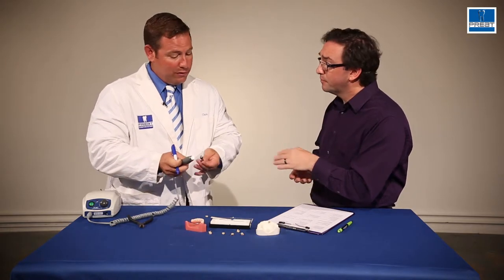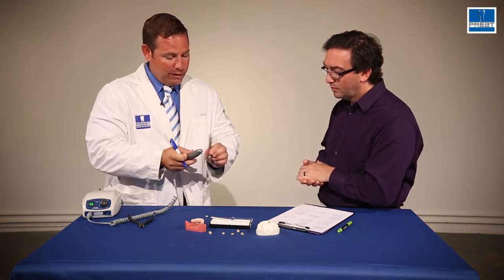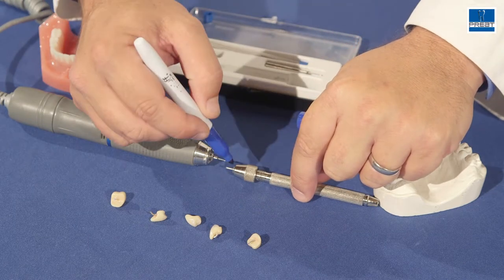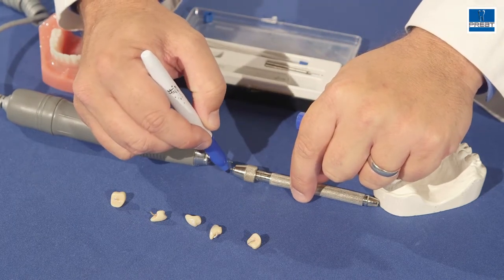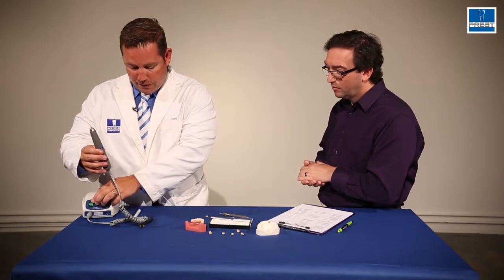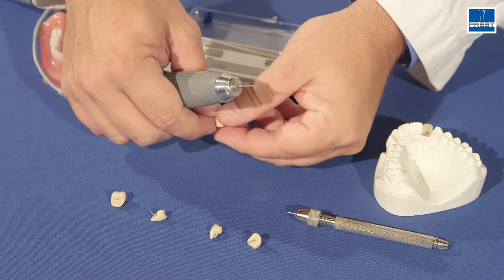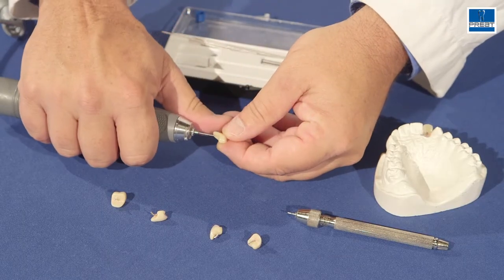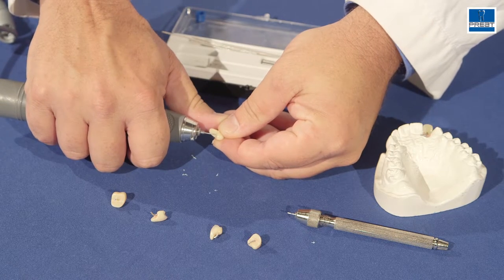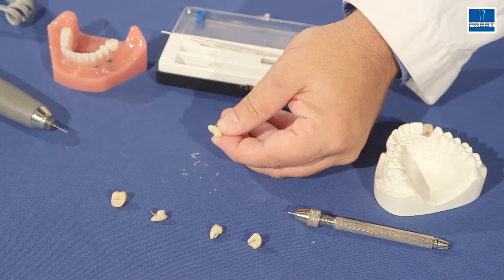Then I'll come over to the wire and see where that one millimeter is, and I'll mark the wire to know to stop threading it in. Then I'll turn this on and basically what I'm going to be doing is tapping threads into this denture tooth — and you just know where to stop because you run into that mark.